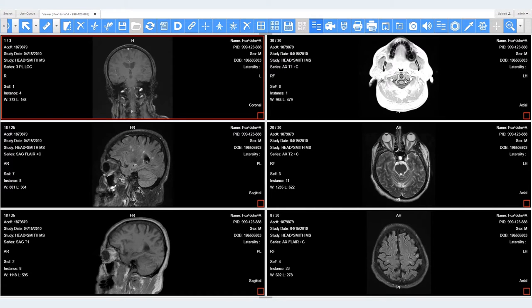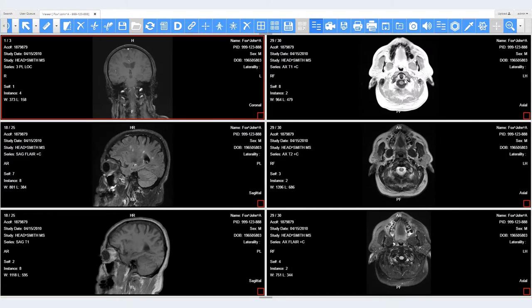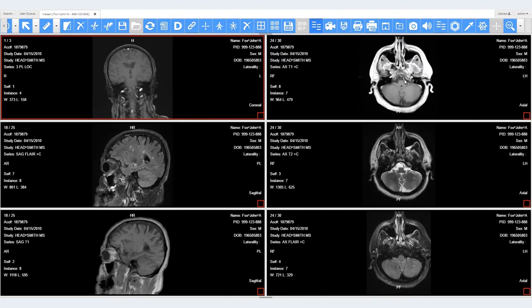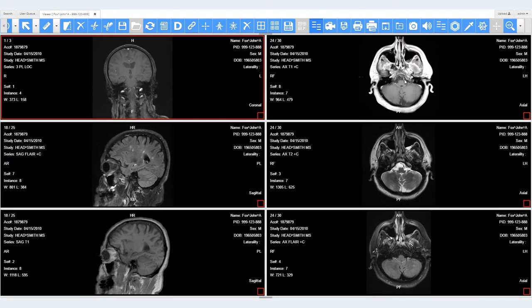Images scrolled out of sync will correctly realign once a stack is selected or scrolled after re-enabling synchronization.